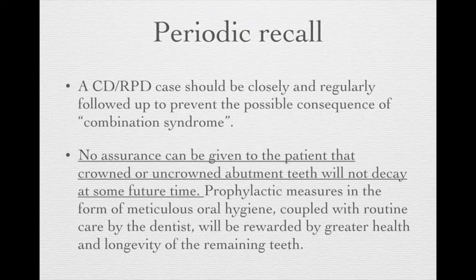So the RPD delivery doesn't mean that we have already changed the patient's pattern of dental care. If patients still keep the original attitude or way of taking care of their teeth, they may still cause problems on existing dentition. And it means that if the patient loses more teeth, the RPD will not fit as well as you expected.